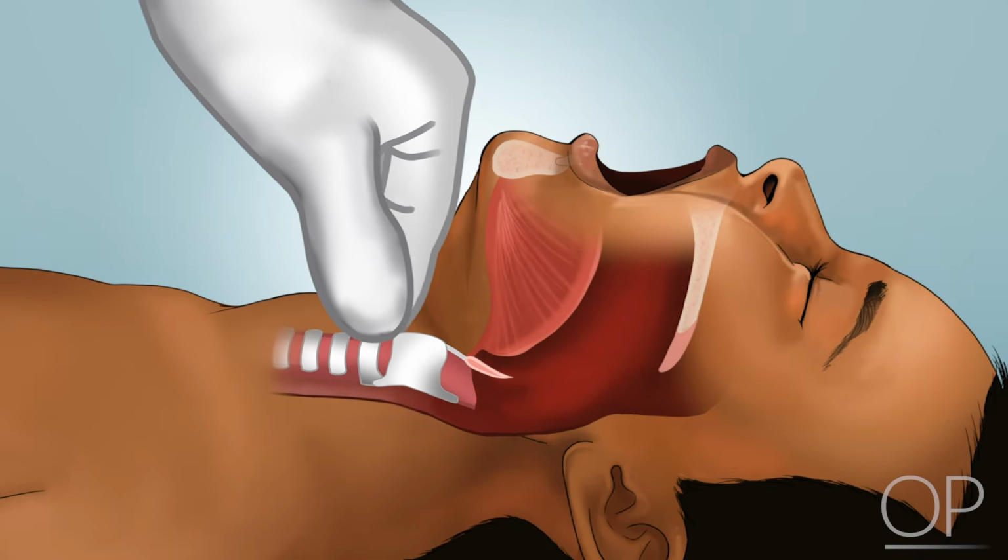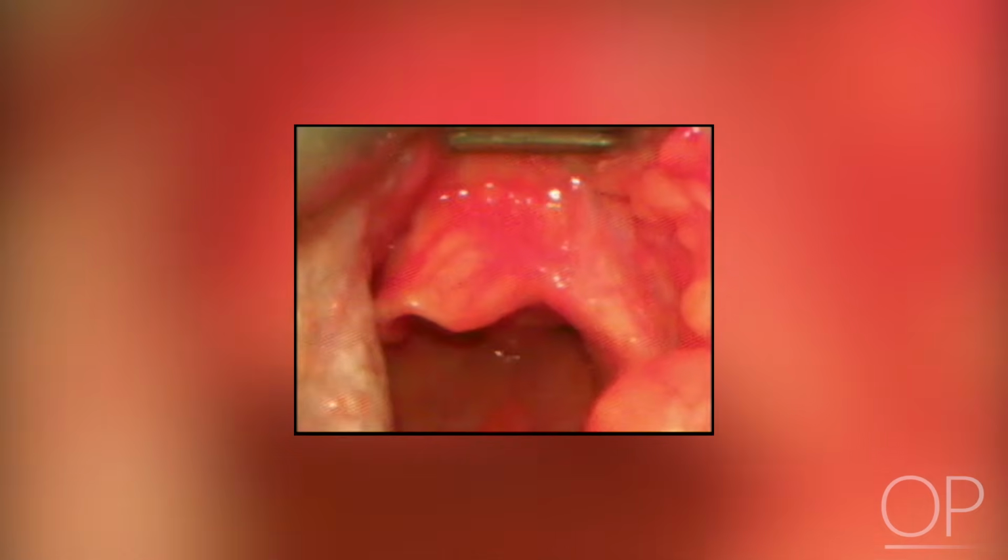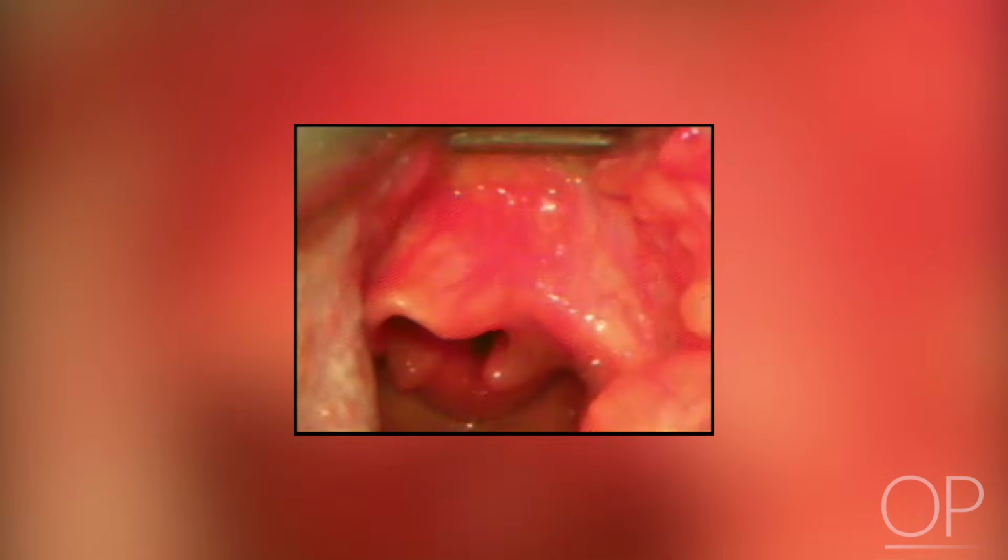Inadequate glottic visualization may also occur because the laryngoscope has been inserted too deep. This is particularly true in young infants. Slowly withdrawing the blade under direct visualization can be used to identify key anatomic structures. External laryngeal manipulation can also improve partial visualization. Gentle pressure on the larynx can move anatomic structures into better view.